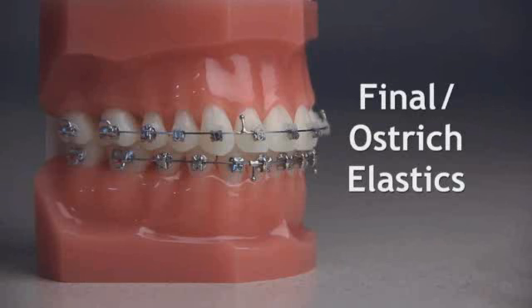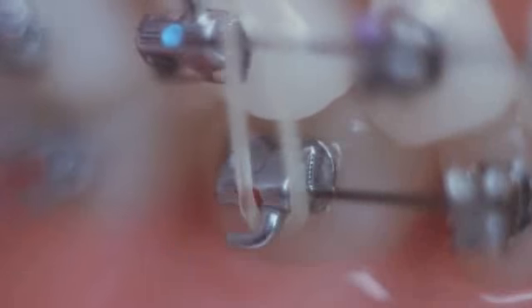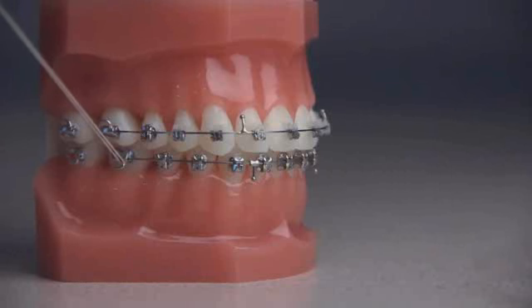Final, or ostrich elastics, generally start on the second to last tooth on the bottom. Just hook the rubber band around the hook on the bracket, then hold it as one strand, pulling it tightly out of your mouth so you have a lot to work with.